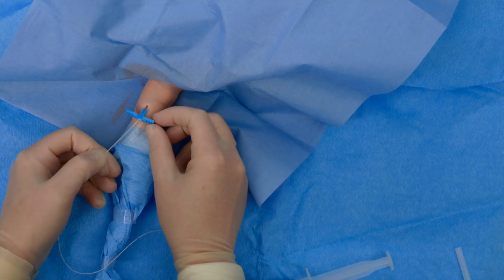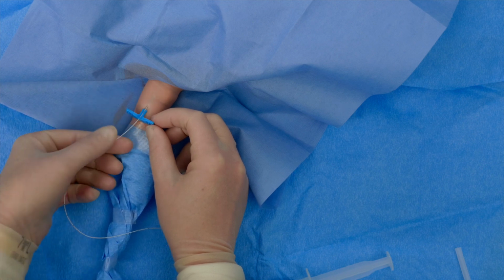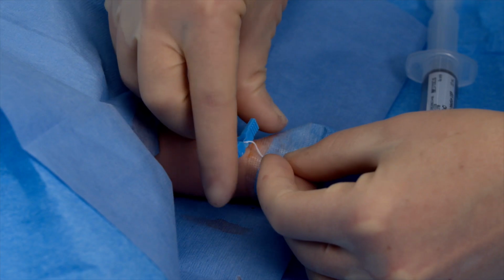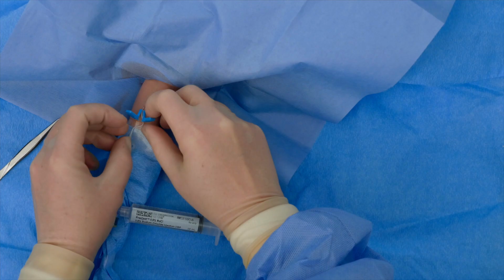The vascular access catheter can now be threaded to the desired tip position. Once the catheter is threaded to the desired tip location, the sheath can be peeled apart and removed, leaving only the catheter in position.